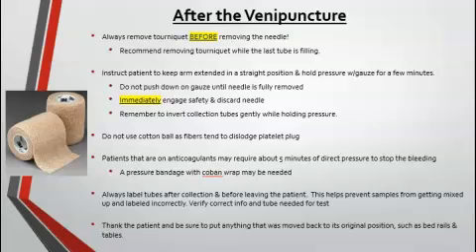It's even recommended that if you've got good blood flow into your tubes, you can go ahead and remove your tourniquet while your last tube is being filled. Make sure that you completely remove the needle from the arm before you put any pressure with gauze to stop blood flow. You can even ask your patients to help hold the gauze if you need to. Also, immediately engage your needle's safety when you pull it from the arm, and you want to engage the safety of the needle using a hard surface.